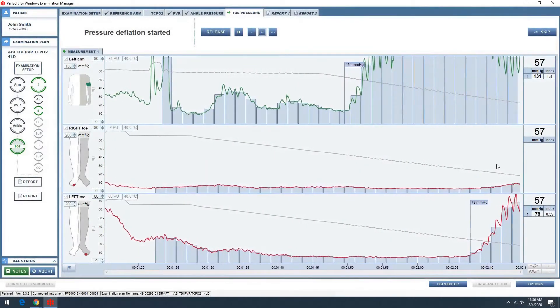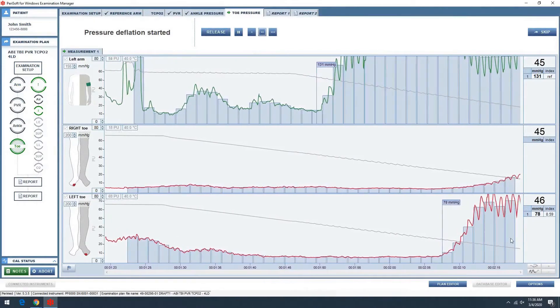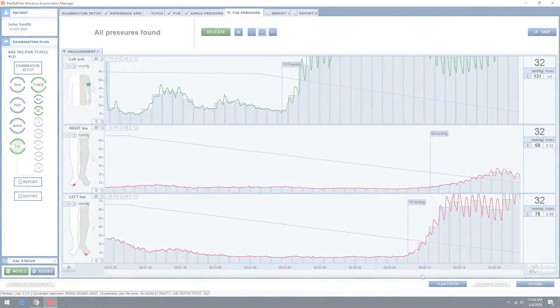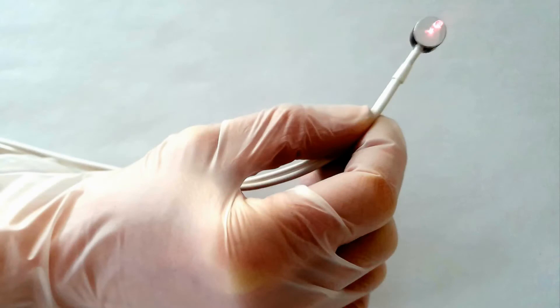Laser Doppler is a sensitive and highly reproducible technique and it doesn't require pulsatile blood flow. Therefore, it's useful for assessment of patients with ischemic and cold feet.